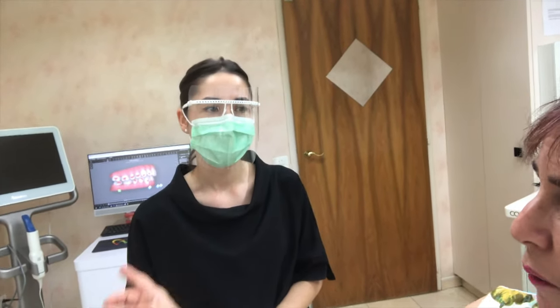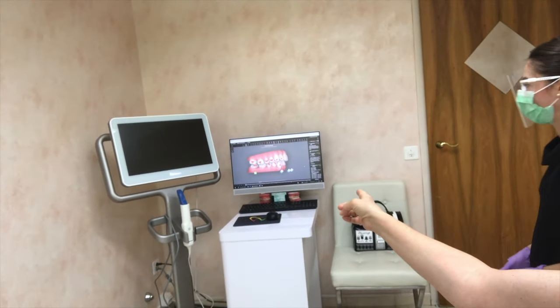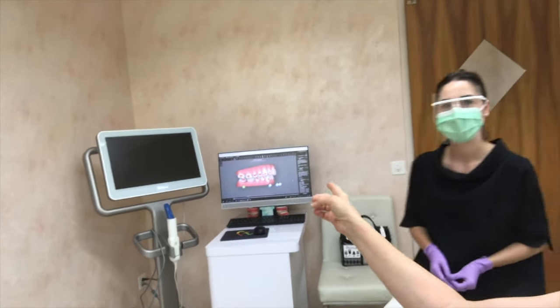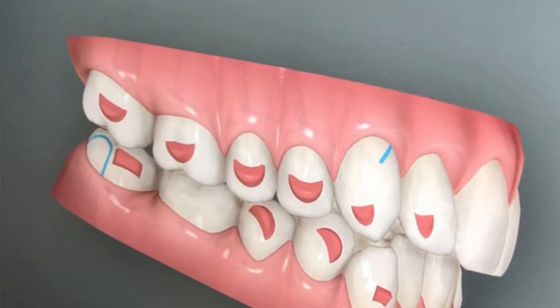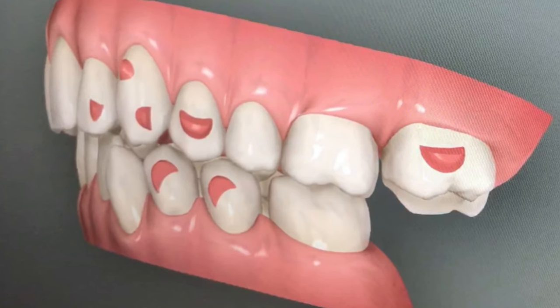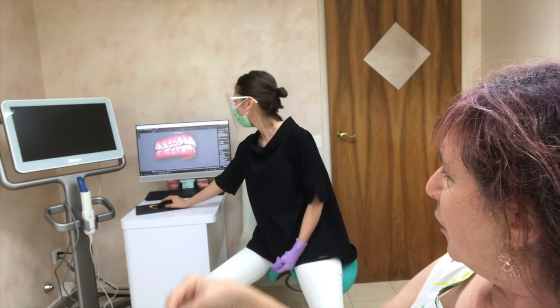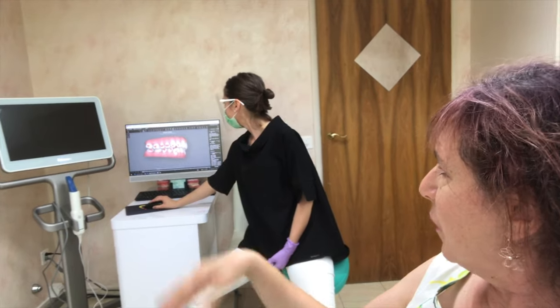So the attachments that I still have on my teeth — are you going to leave those on? I'm going to remove them and place new ones. Do you have a picture on the screen there? Yes — so this is the new attachments. Oh wow, there's actually two on one tooth too. Exactly. That's something new. The other ones I have no idea — they all look the same to me.